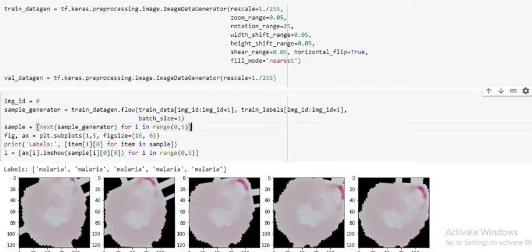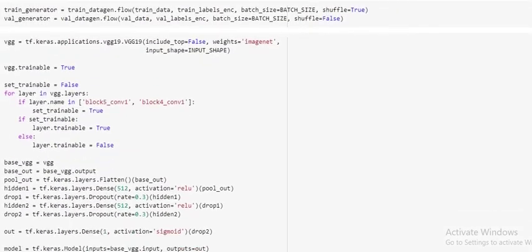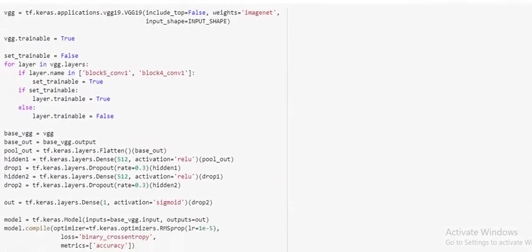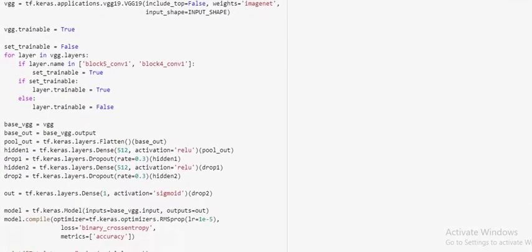Before fine-tuning, we augmented our images. Previously, we froze the convolutional layers. Now, we unfroze the convolutional layers and added dropout layers to avoid overfitting. Now, we have 16 trainable layers out of 28 layers.